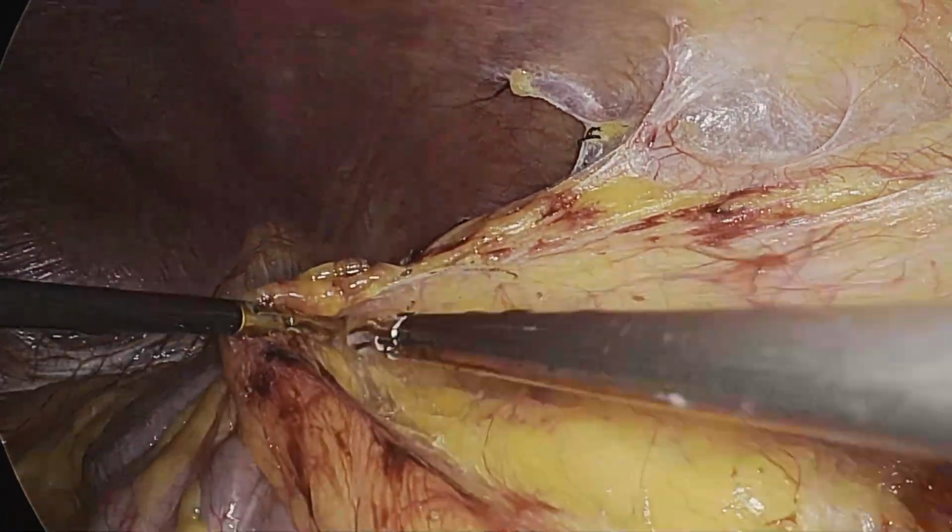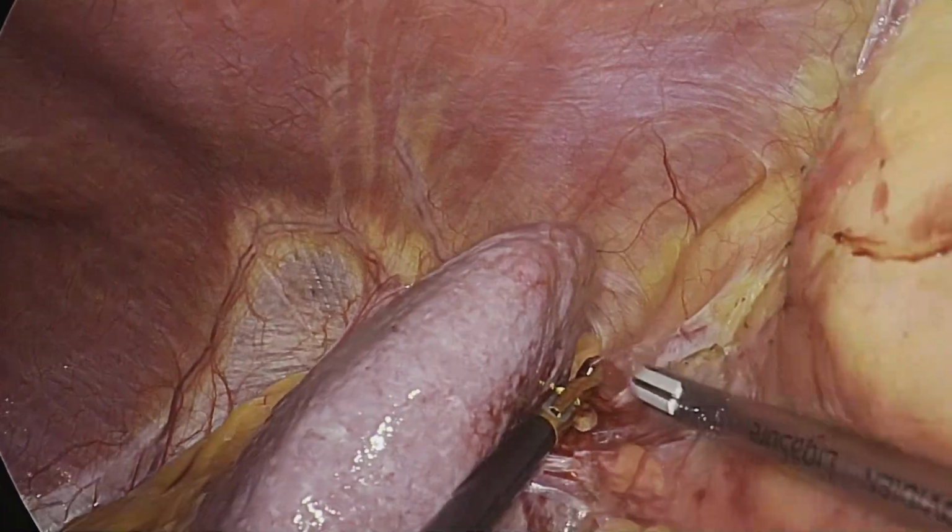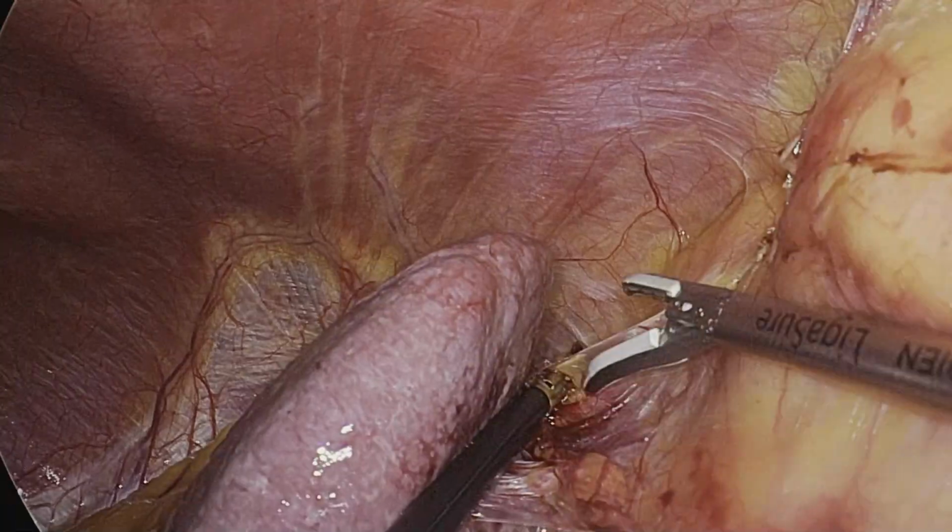The plane between the Gerota's fascia and the mesocolic fat should proceed in its entirety.